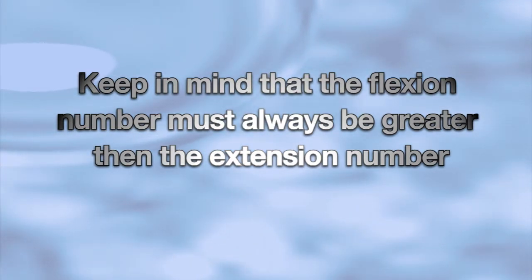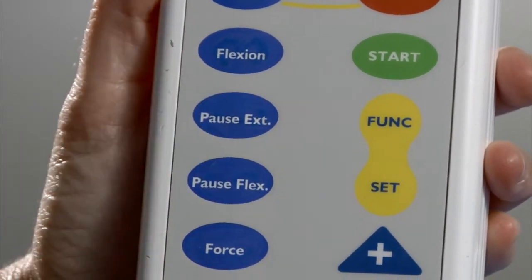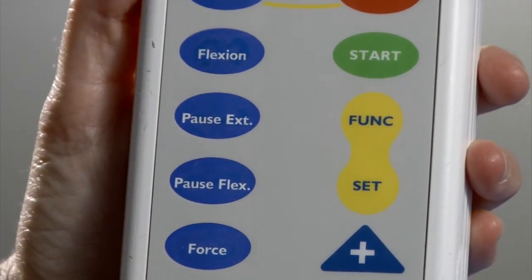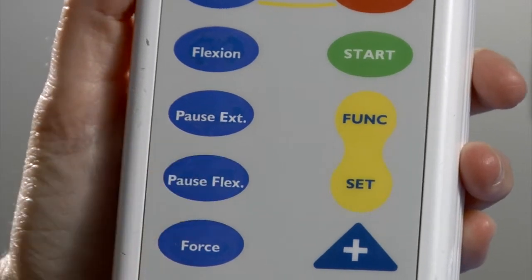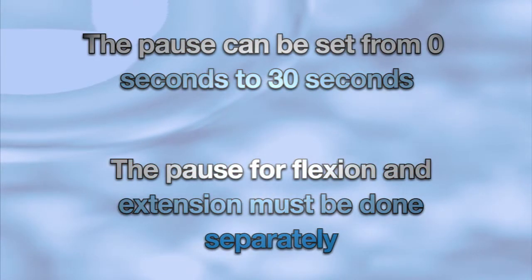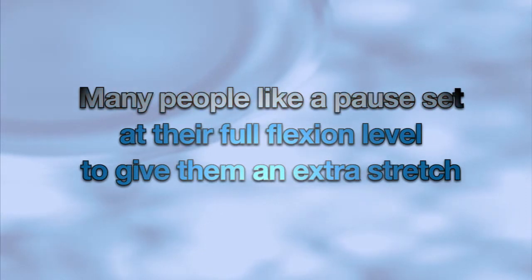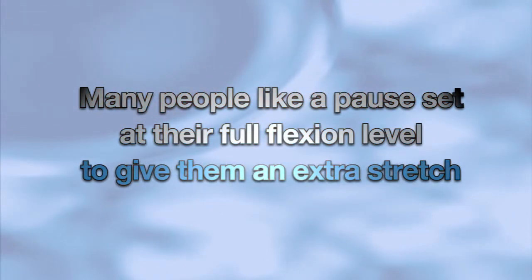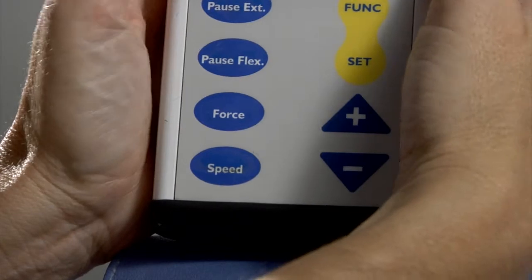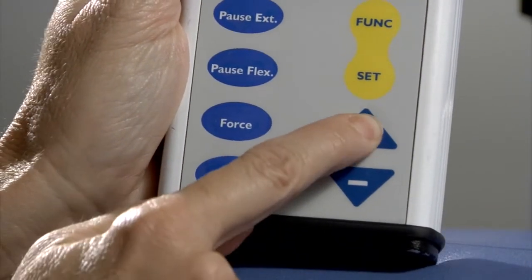number on the left. To adjust the pause time, hit the pause extension or pause flexion button and adjust the time using the appropriate arrow until the desired length of pause is reached. The pause can be set from 0 seconds up to 30 seconds, and the pause for extension and flexion must be set separately. Many people like to have a pause set at their full flexion level to give them a little extra stretch. Finally, to adjust the speed of the machine, hit the speed button followed by the appropriate arrow.